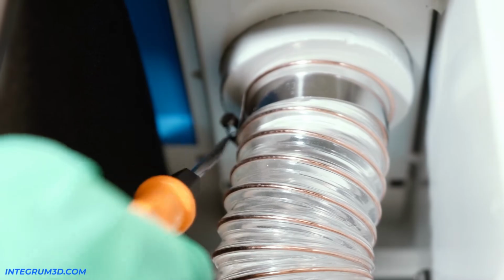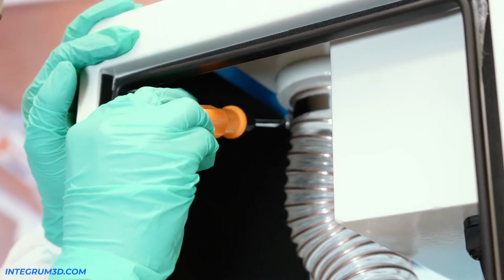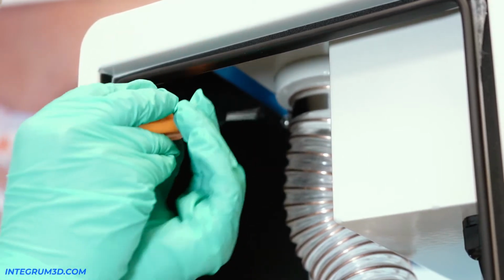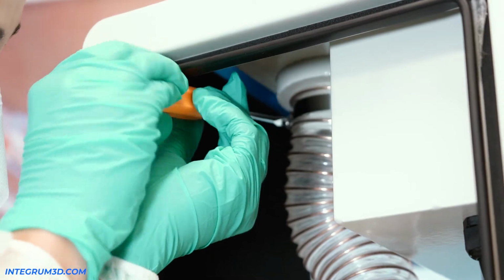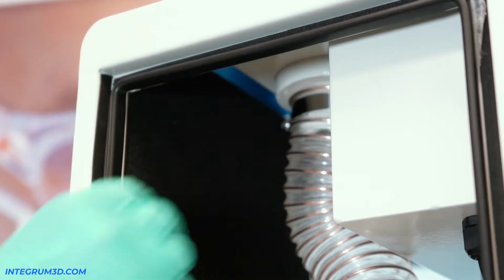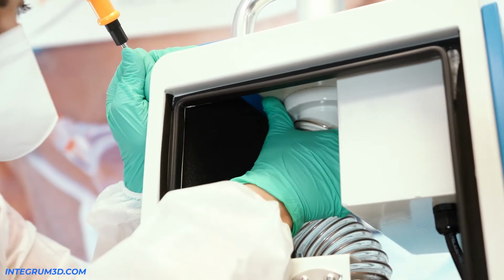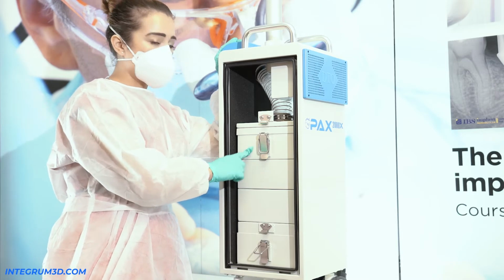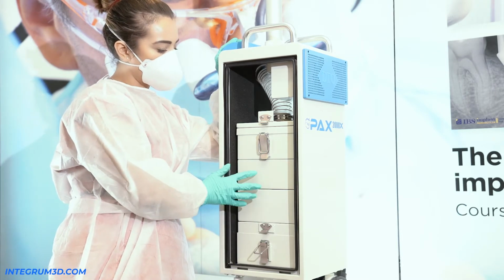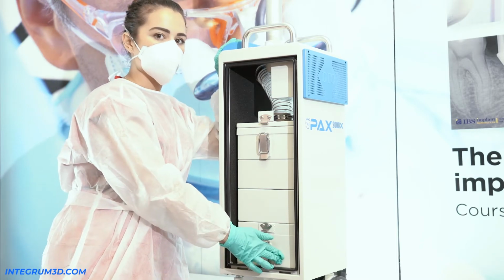You're going to find the screw that's back here next to your tubing. I'm going to turn it just a little bit to loosen it, enough to pull the clamp down. There we go. And then pull down all the way and away from the inner tubing. In the back here, you have your fine filter, your motor, your UVC light bulb, and your HEPA 14 filter.